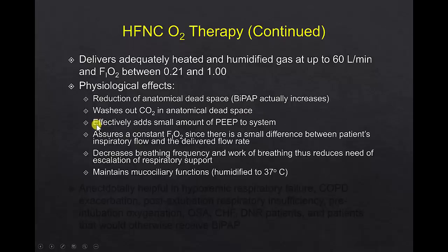High flow flows in so fast that it actually builds up a back pressure, because it's going in so fast that at first there's a disequilibrium and the flow doesn't quite come out as fast as it goes in until the pressure builds up. We can build up PEEP of about 3 or 4 in the system at the nose and the oropharynx above alveolar pressure. So really it adds PEEP to the system to a small degree.